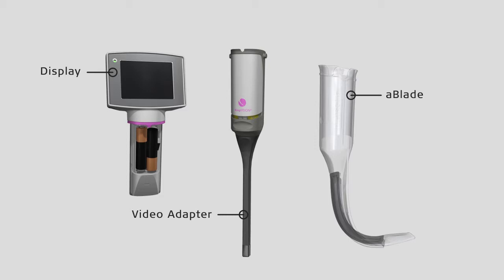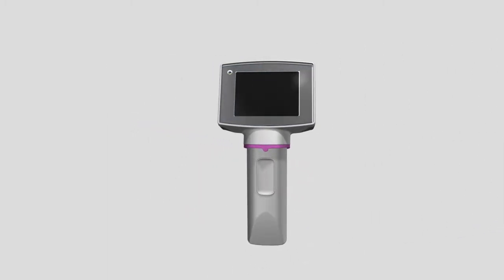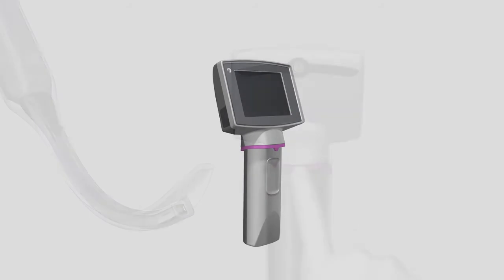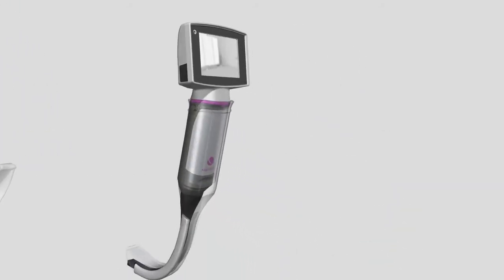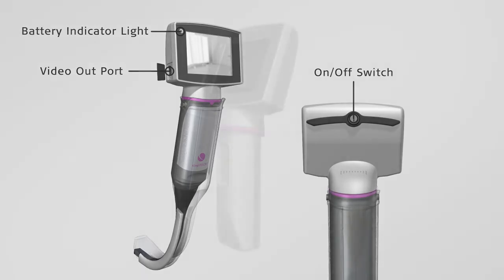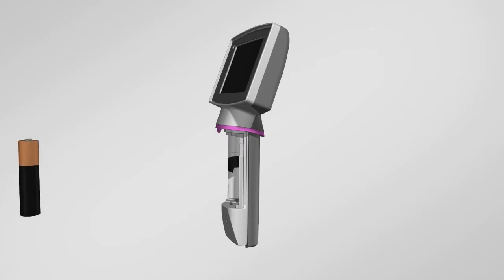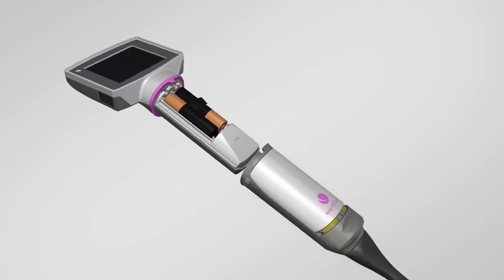tube. The main component of the KingVision system is the durable, high-quality, portable, battery-operated display with a TFT LCD screen, which receives images from the distal tip of the video adapter and displays the image on the integrated full-color anti-glare screen. The display has an on-off switch, a battery indicator light, and a video out port. An advanced power management system provides automatic gain and exposure control. The video adapter connects to the display in order to transmit an image when turned on.